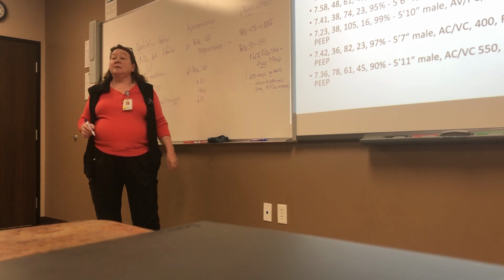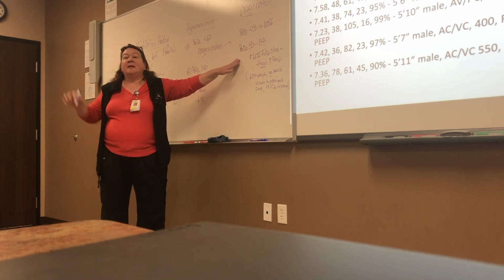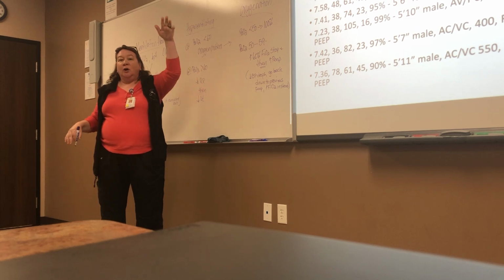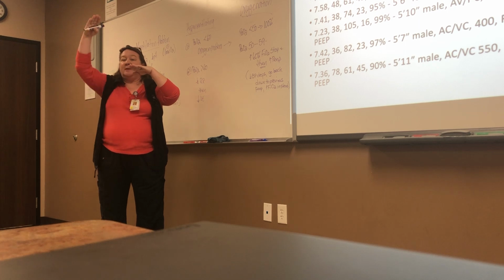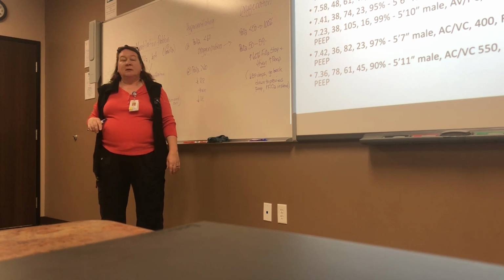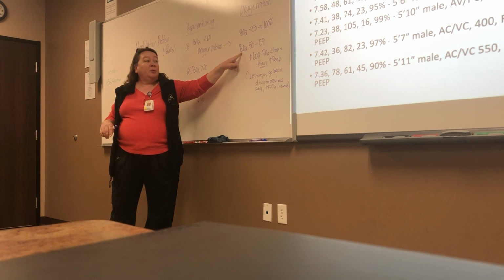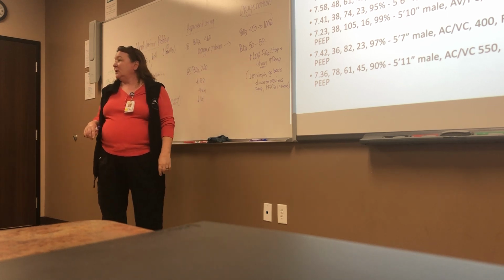When you say stop, you mean stop at 60% and then go up on your PEEP. So if they're on 40, you would go 50%, 60%, stop increasing FiO2 and then go up on PEEP instead. Stop and watch what happens first. I'm just saying if you get to 60% and you're still having problems with your PaO2, then you go up on PEEP. Can you take ABGs in between all these changes?